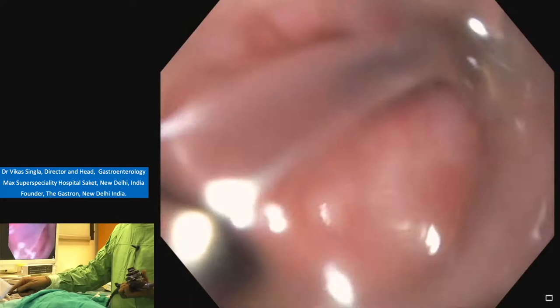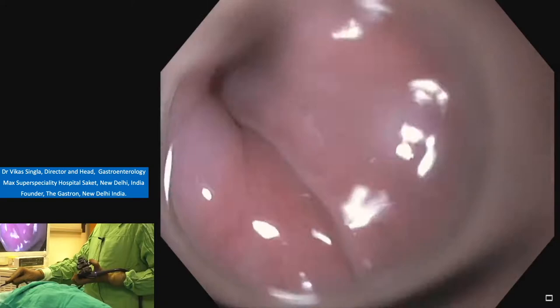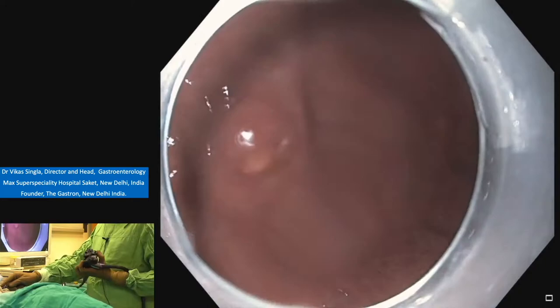So there is no emphysema. One should keep on checking for the air leak. One should look for the airway pressure. One should look for the CO2. And clinically, one should look for the pneumoperitoneum or surgical emphysema. Stomach is distended. We will deflate the stomach.